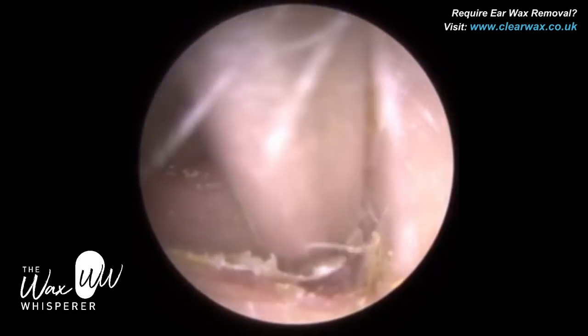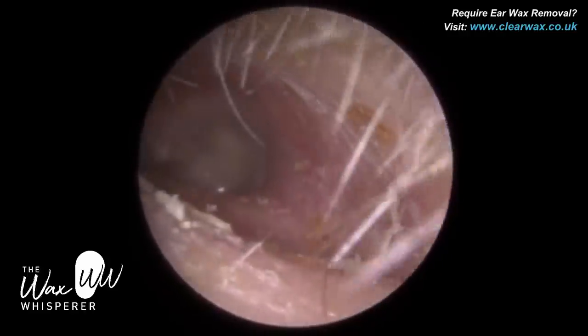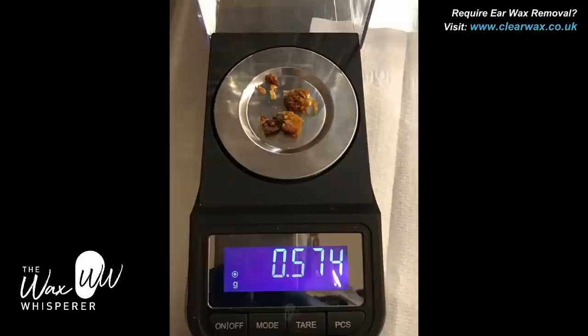When you know the ear anatomy — the shadows, the different bends and twists of the ear — and also something called motion parallax: just by moving the endoscope forwards and backwards, you can judge the distance by the speed and knowing the length of the ear canal. Sorry to go a bit into physics there, but as demonstrated in both procedures, I'm able to get depth perception with an endoscope. It does take a bit of skill and practice, but it's possible.